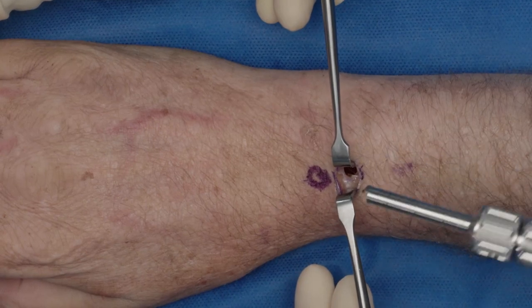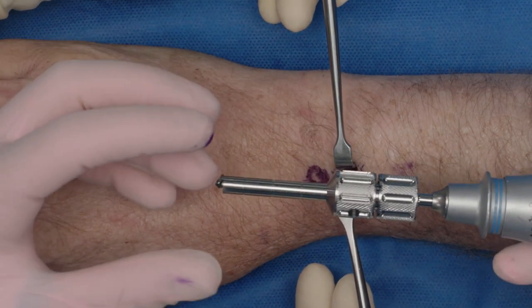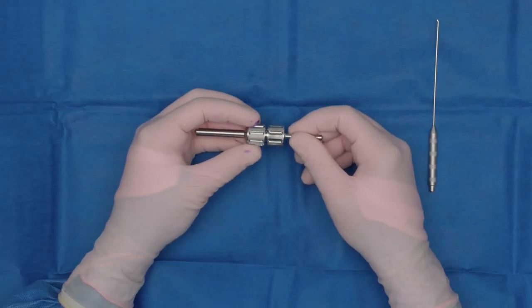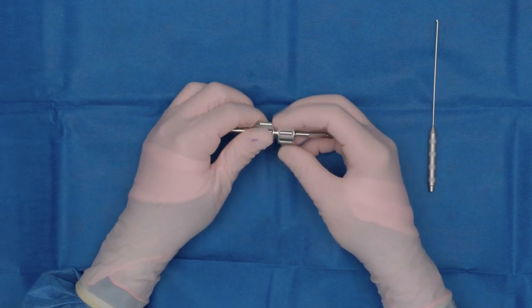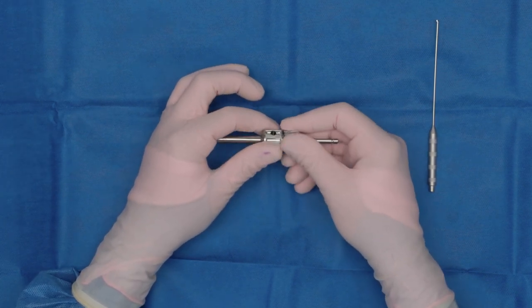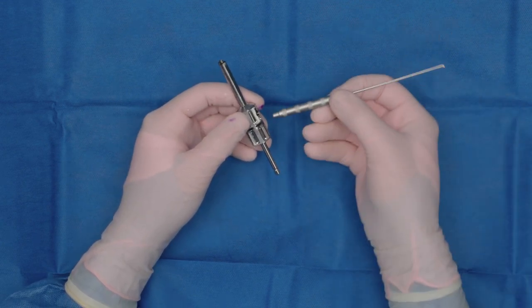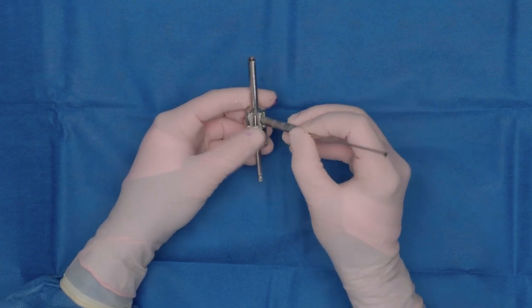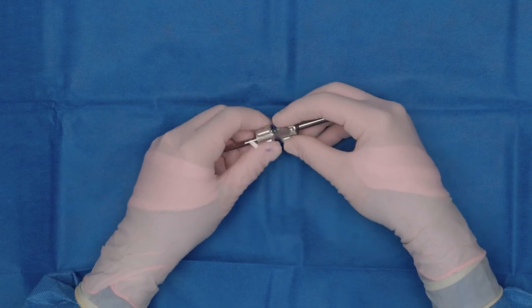With each pass, you can do up to three passes before you disconnect the harvester and get your bone graft out of the shaft. Now that we've made our passes, we are ready to disconnect the system. You can manually twist this apart; however, sometimes with the torque of the drill, this can be harder to disassemble. Therefore, you can take the plunger and place it in the hole on the OsteoAuger to use as a lever arm to help get leverage to open it up.